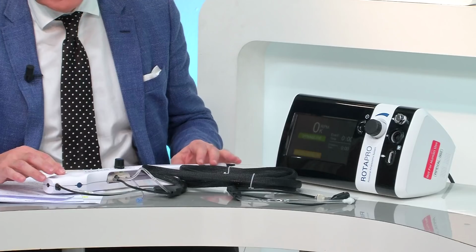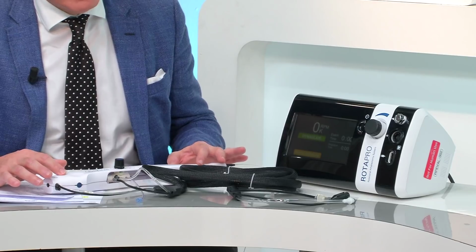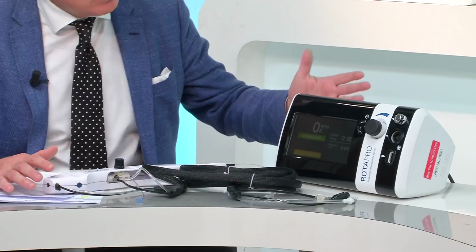So Adam, as you may know, there are 3 main components. The first one is the burr, and there is no change on the burr. Then you have the advancer, and there you will see that there is some important modification on the advancer. And finally, you have the console, which is completely new. First, we will look at the console.